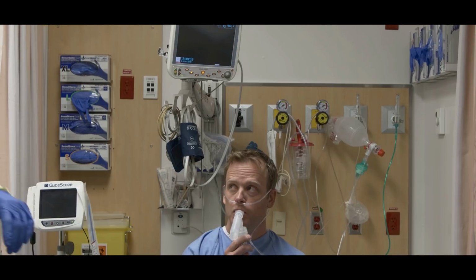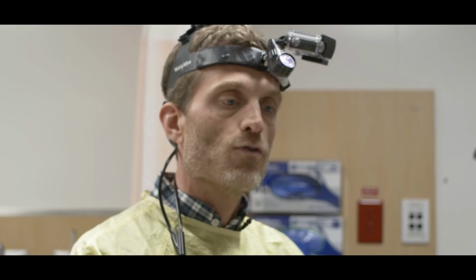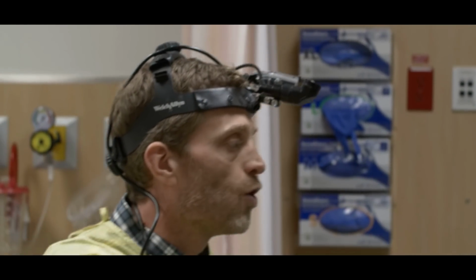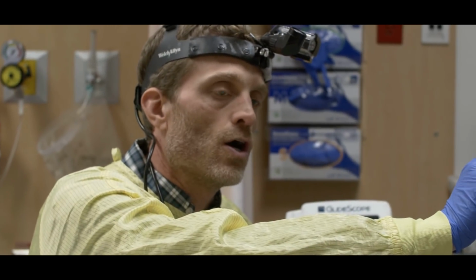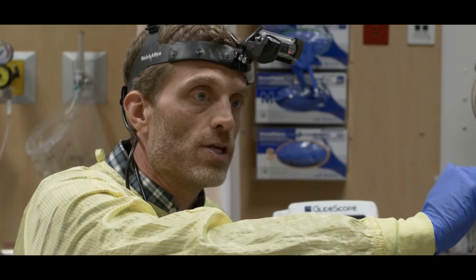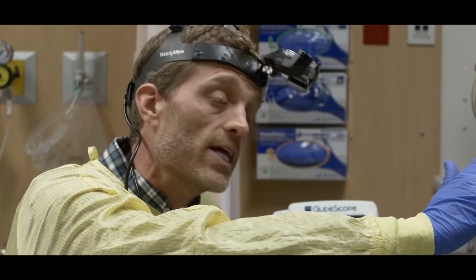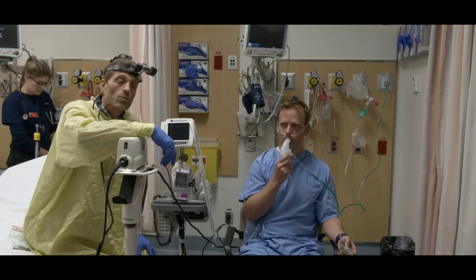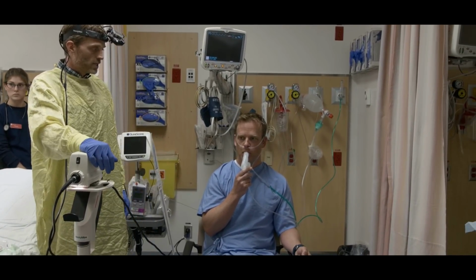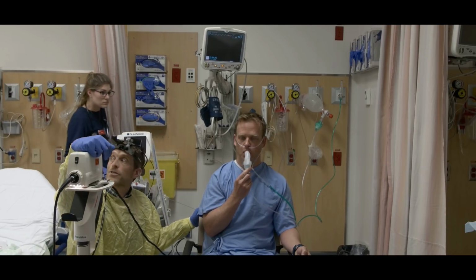And I'll just talk while we're doing this nebulization. What's the flow rate you have, Marika? 4 liters. 4 liters, so very low flow. We know that the lower the flow rate, the larger the particles that are generated, and the larger the particles that are generated, more of them will rain out in the upper airway. The smaller the particles have a higher chance of getting down into the lung. That's not where we want them. We're trying to anesthetize the upper airway. So just 4 liters. Marika, I'll let you tell me when it's completely empty here.